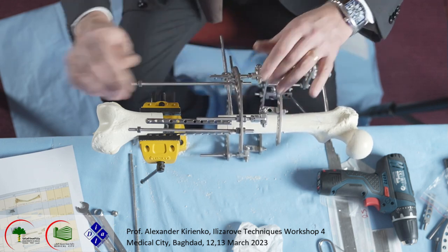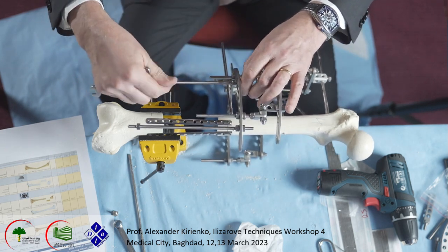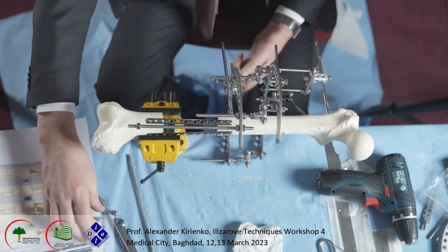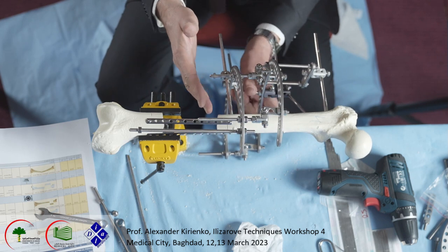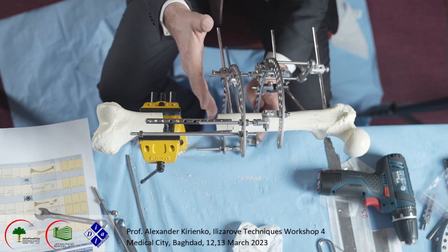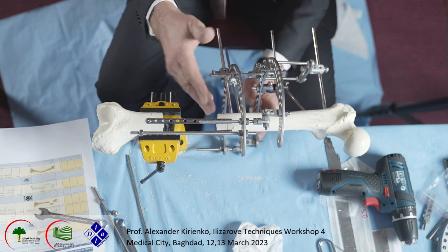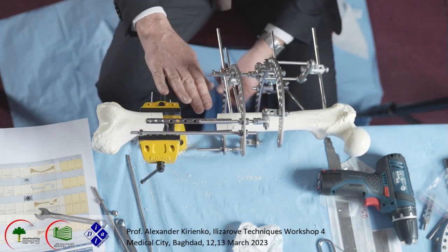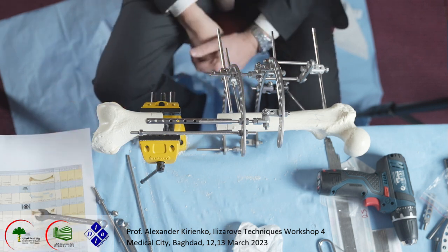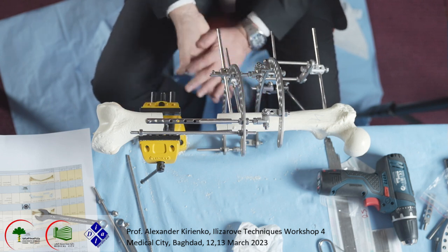After that, this rod I put here only for orientation. Imagine now, with this frame, I do the resection of the bone. I did cleaning and everything. Here I put a little bit long rod, maybe if it gives me a problem in surgery, I remove it. After that I rebuild it. I do a lateral approach, resection, cleaning of the infected bone, and I achieve this big defect. This defect we have in the femur, we have only one bone, if you know.